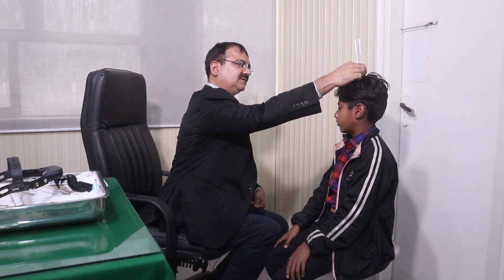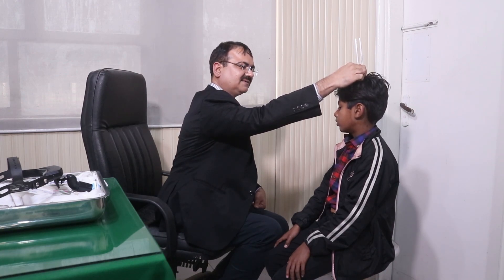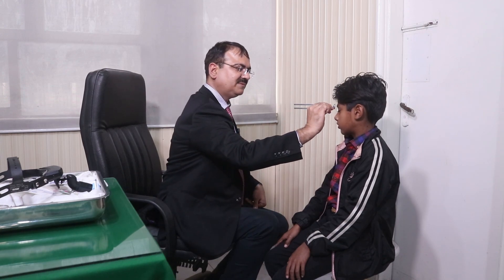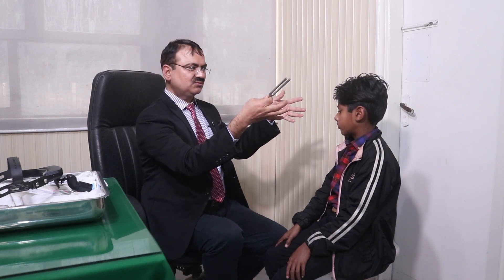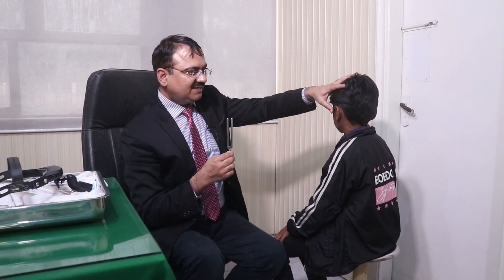The other test is to assess conductive hearing loss. You can see the placement points here: the glabella, the vertex, and the upper teeth. We ask the patient which side they hear the sound louder — this determines the lateralization. You can also note any difference between each ear. Every characteristic assessed here relates to the masking effect.